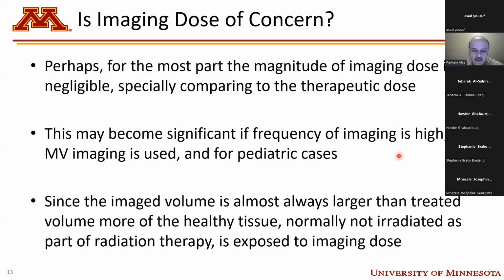And then you have to keep in mind, the imaged volume is almost always larger than the treated one. So more of the healthy tissue, which is spared as part of radiation therapy, is exposed to imaging dose, albeit it may not be high magnitude.